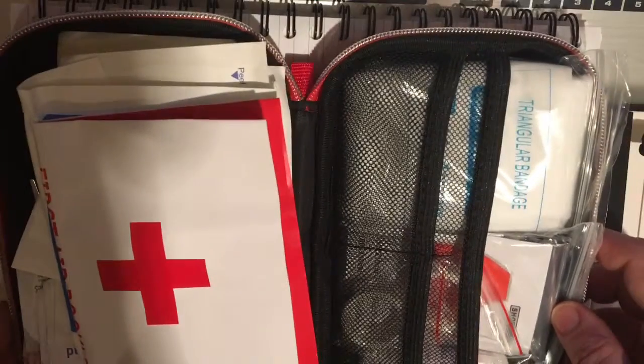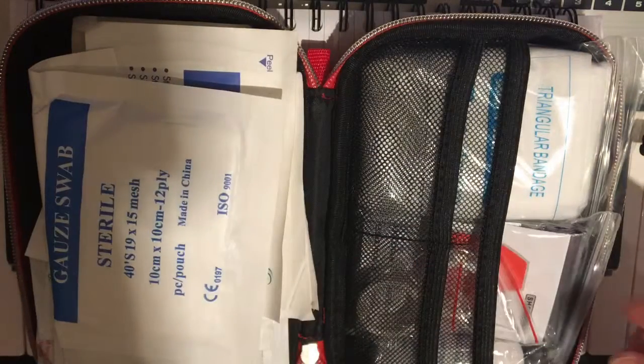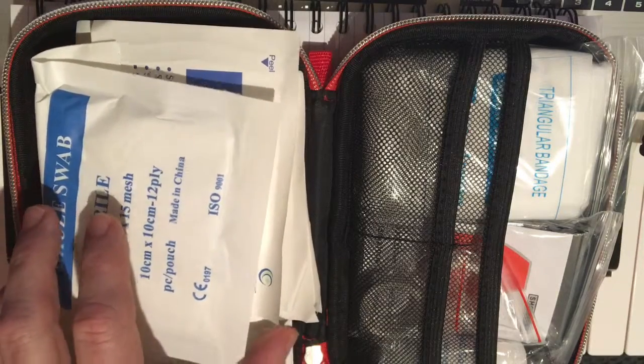I'm going to flip it this way. On the left we have a little first aid manual. It covers the basics of things like burns and broken bones and minor injuries and what to do in an emergency. So it's a good overview to have in there. There are lots of great first aid texts that I'm sure you guys are familiar with that you can include in here.